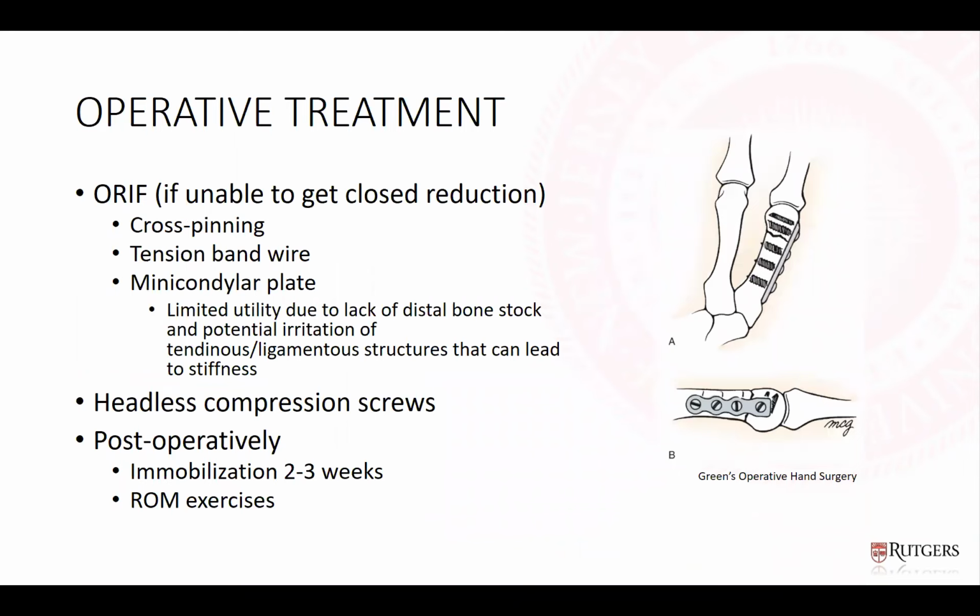ORIF is always an option. Specifically, if you can't get the reduction closed, you can still pin even if you do an open reduction. Tension band wiring has been described, and mini condylar plates do exist, although these occasionally have limited utility depending on how distal the fracture is. Headless compression screws have become more common in the last decade, and we'll talk a little bit more about those later. And then postoperatively, usually you're immobilizing these for 2 to 3 weeks and starting range of motion exercises.